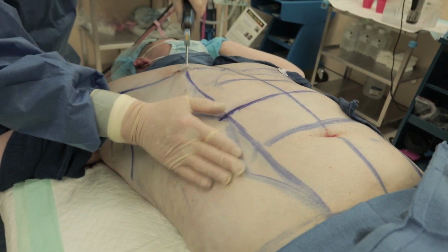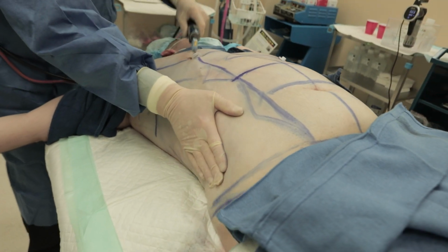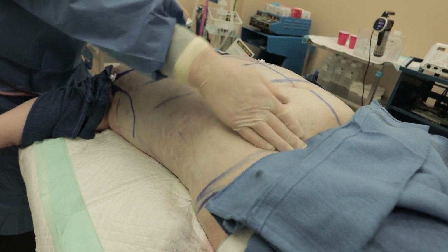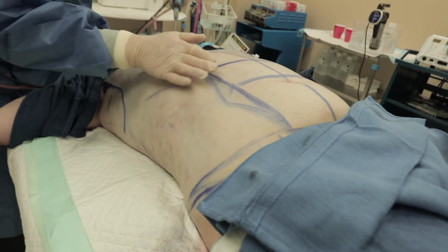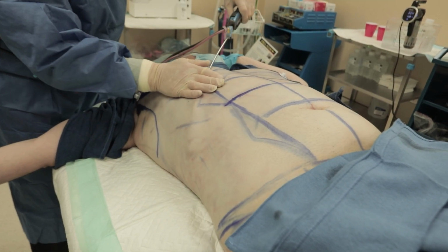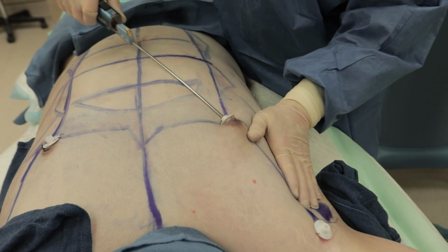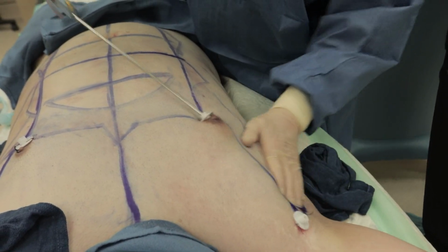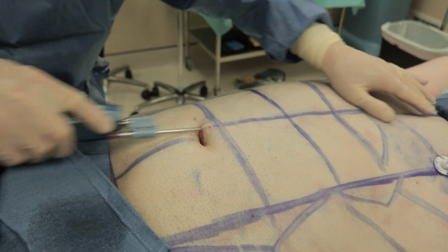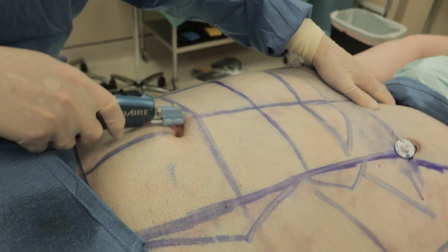Now with the nipple a little lower, I can get, so see where I am? Way to his hip here. So I go from top, middle, and bottom to get very different areas without incisions all haphazardly around. Gland. Get into the armpit a little bit. I can etch this volume between, if we're not doing any pectoral lipo filling. So I want to give them a little interest up here.